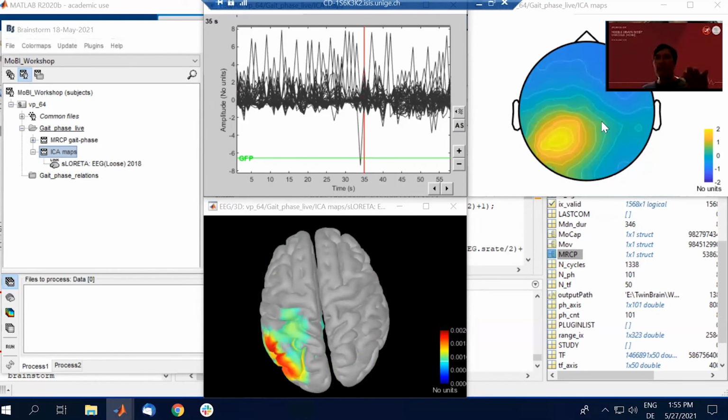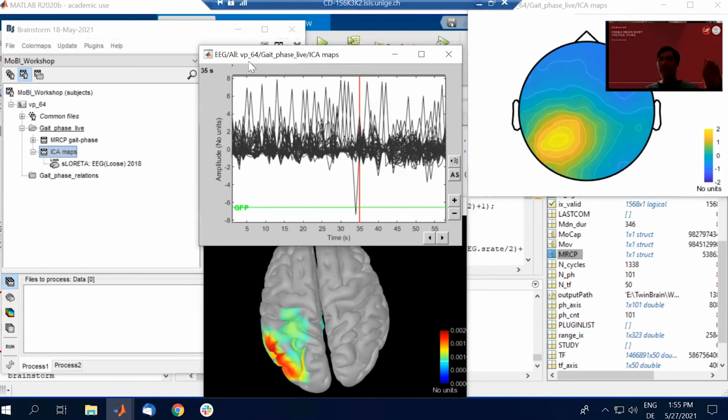We have some configuration and all linear transformations you do from your data, you're still able and it's valid to source localize. If you do non-linear transformations, these relationships are violated, meaning if you would have some kind of power topography and you try to do that trick here, that's not correct, because then the mathematical equations are violated.